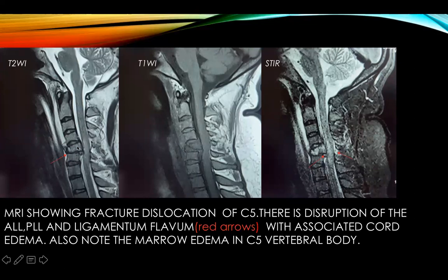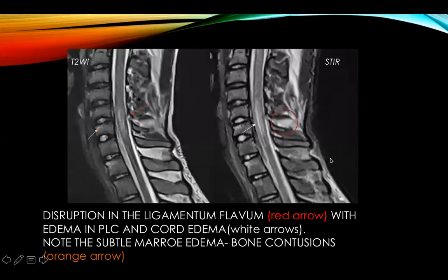This case shows dislocation of the C5 vertebral body with retropulsion of the fracture fragment. There is a breach in the continuity of the ligaments — the ALL, PLL, and ligamentum flavum — as depicted by the arrows, along with cord hyperintensity suggestive of cord edema.